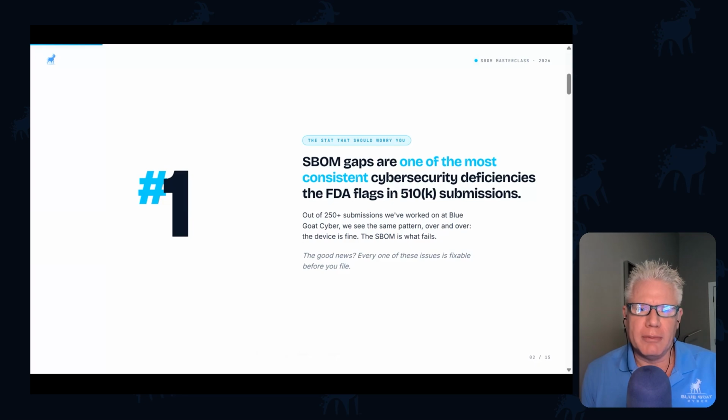One of the most common deficiencies we see at Blue Goat Cyber with FDA pre-market submissions is that the SBOM is either missing or it's not done correctly. Unfortunately, we work with a lot of clients that have done a submission and they received a deficiency response from the FDA, and we help them with that deficiency response. And the number one thing we see is an incomplete SBOM, a non-machine readable SBOM, or lack of vulnerability descriptions in the SBOM, and we're going to cover those here.